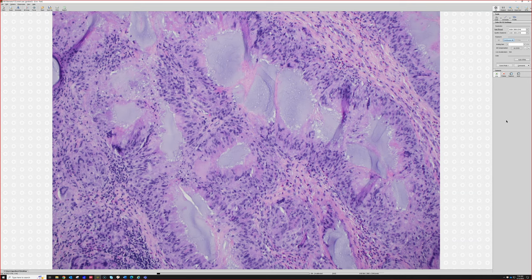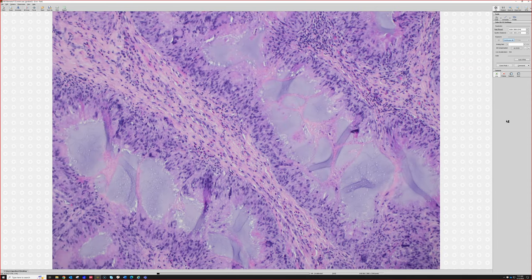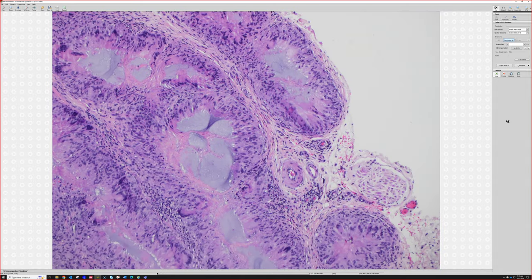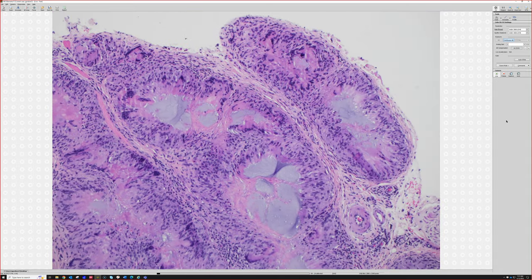Hyaluronic acid. Exactly. It looks blue, like myxoid, or the type of dermal mucin we see, which is hyaluronic acid. And this is injected hyaluronic acid filler where the patient's body has had a massive granulomatous host response. And I don't know why this patient had this host response. Someone asked me, does filler always produce this kind of reaction?